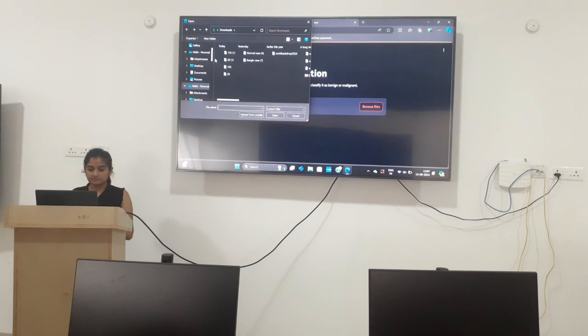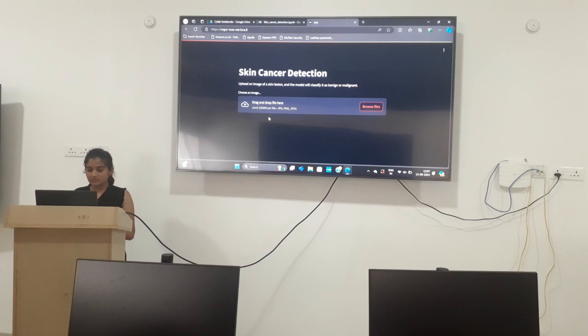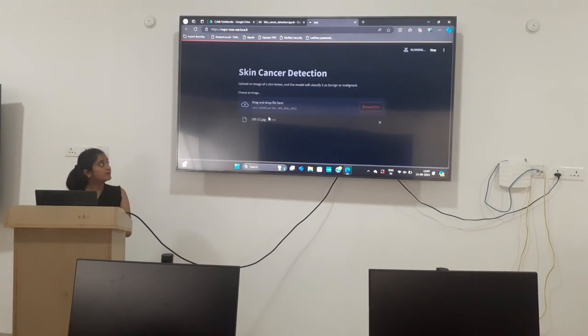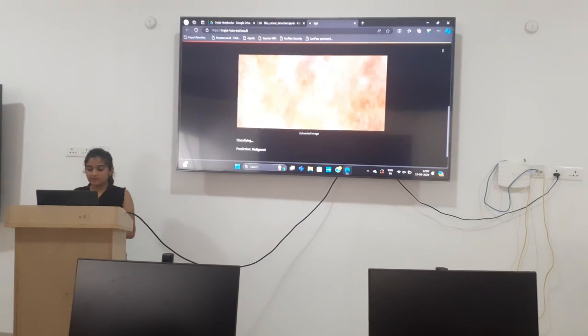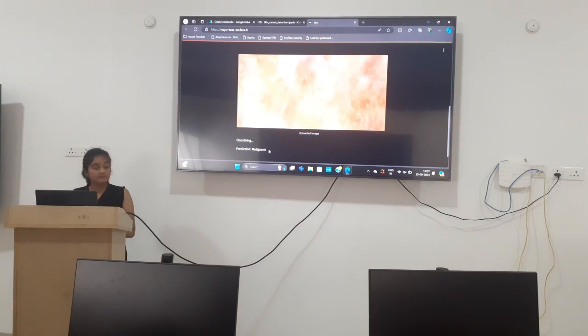Now we will upload an image. I am uploading an image of malignant. Let's see whether our model predicts it correctly or not. It's getting loaded. This is the image I uploaded, and we got the prediction as malignant, which is true.